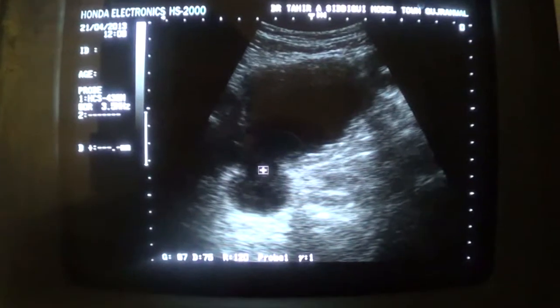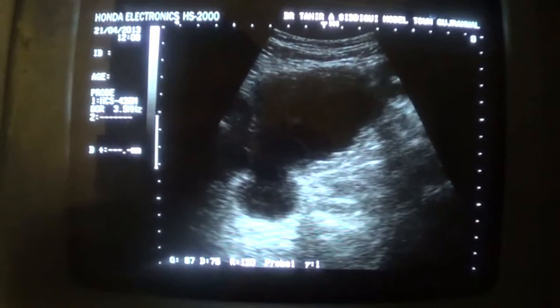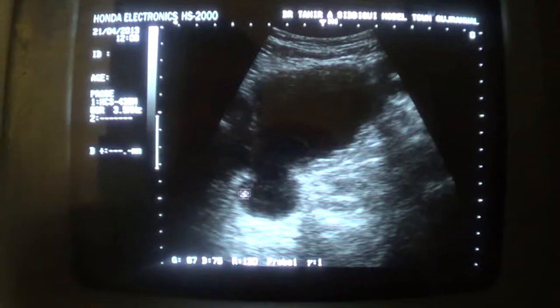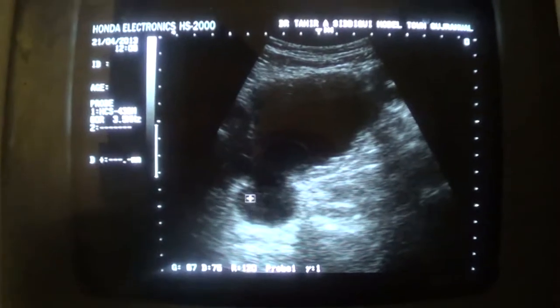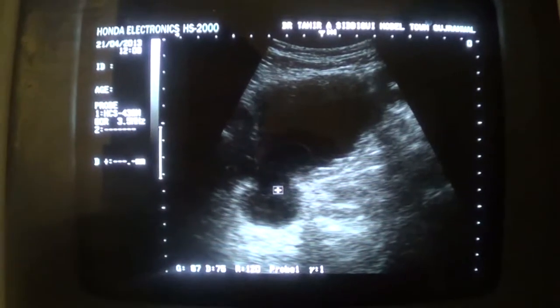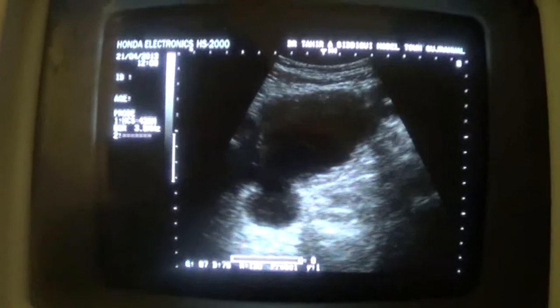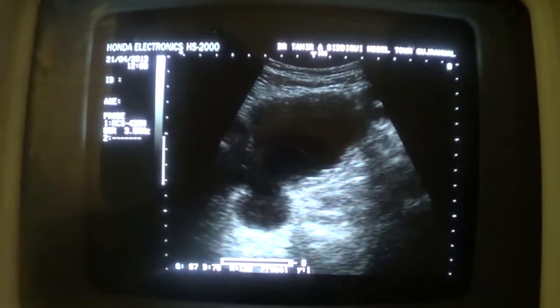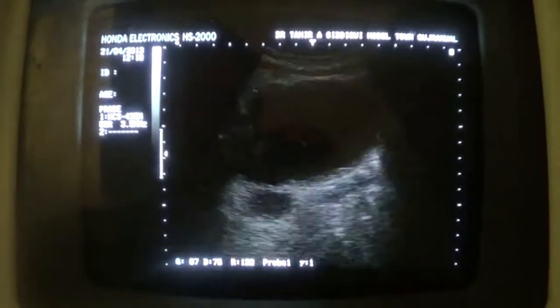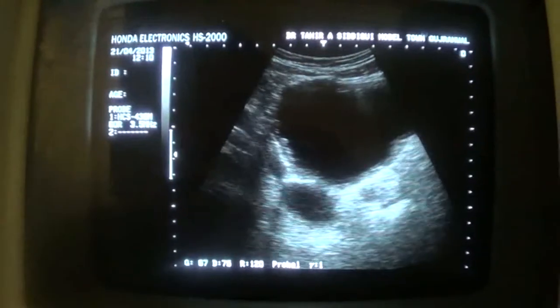This is the opening of the diverticulum with the urinary bladder. There is no debris and no calculi seen in this diverticulum. So this is the diverticulum.